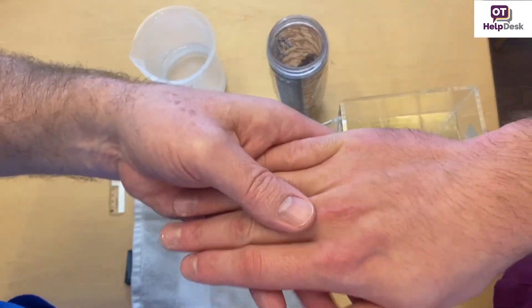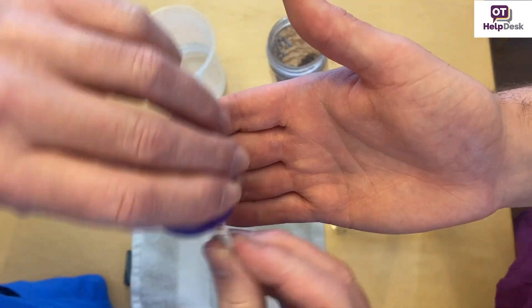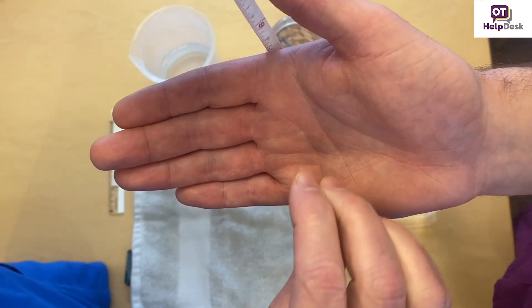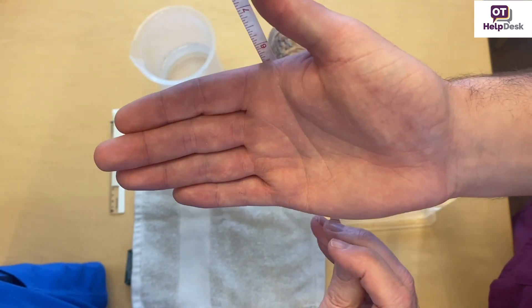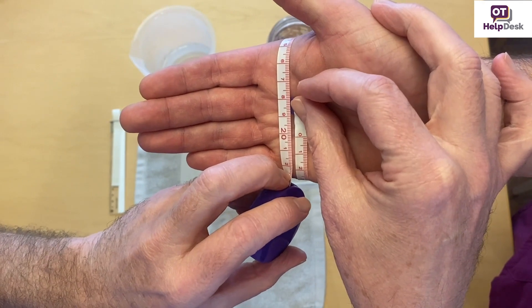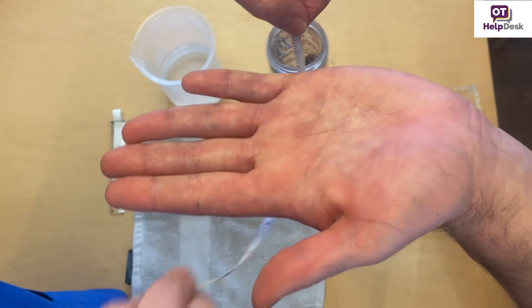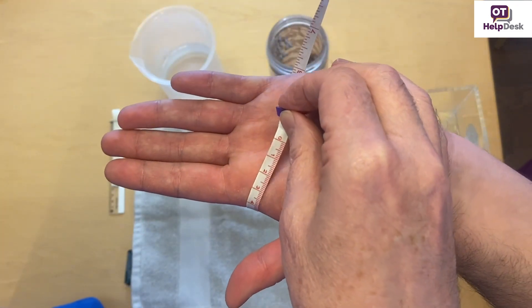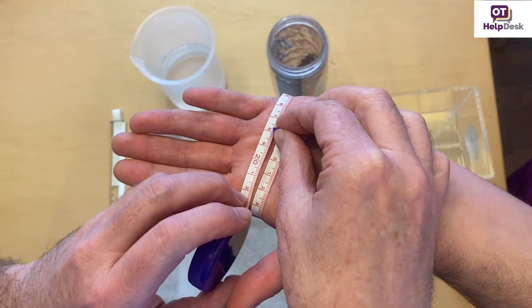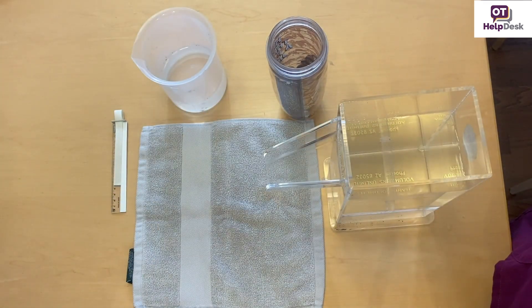Now let's do the next measure, which is going to be the transverse palmar crease. We're going to measure right from here and come across the back. It sits nicely just behind the MP joints, and we measure — you're at 20.2. Let's measure the other one. Come across here; it sits right behind the MPs. And we're at 20.1 to 20.2. So not too much of a difference there, which is logical.